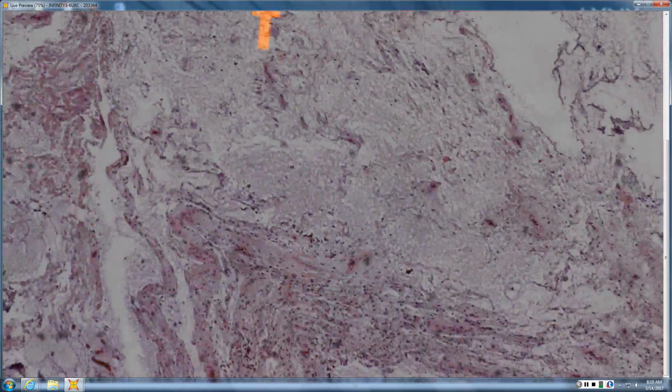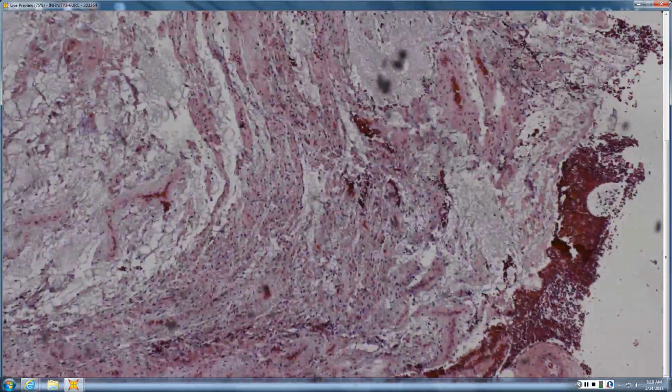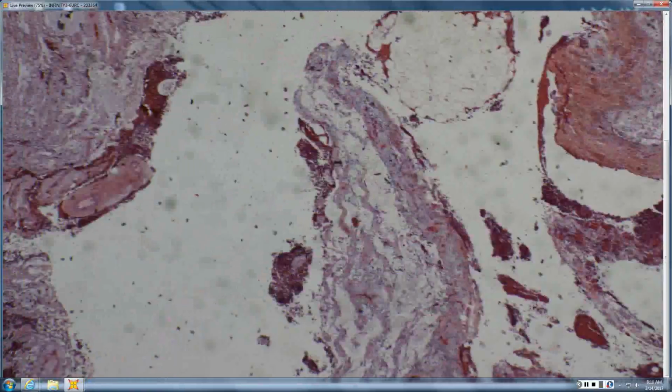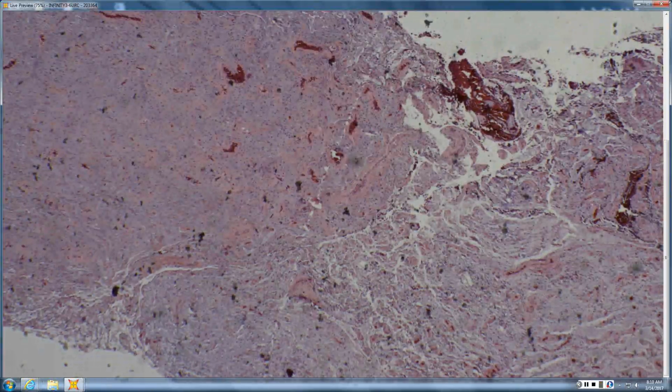Definitely very myxoid. Why is it so full of blood vessels? Do you know anything that's an angiomyxoma? Yeah. So tell me about angiomyxomas. I think you could see them in Carney complex. You can see myxomas. Yeah, you can see myxomas, and the angiomyxomas come in two basic flavors. There are superficial ones, which are often in kids, and those superficial angiomyxomas are totally benign. And then you have the vulvar ones in adult women that go under the name aggressive angiomyxoma.